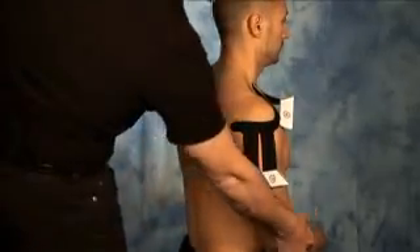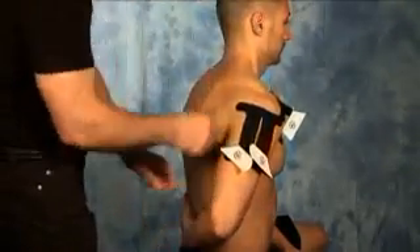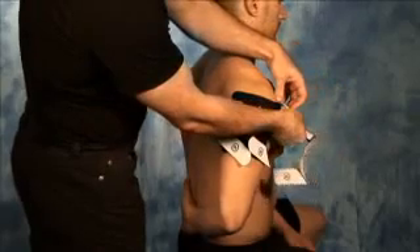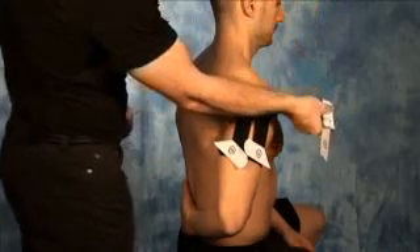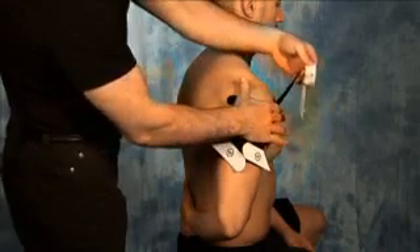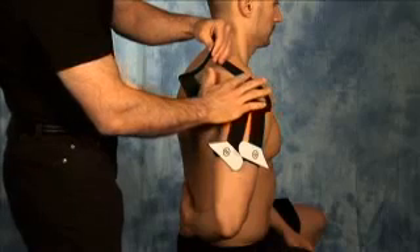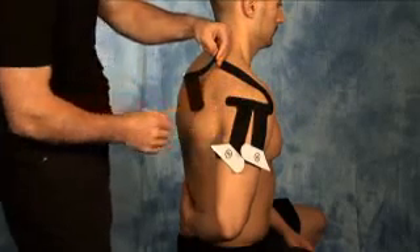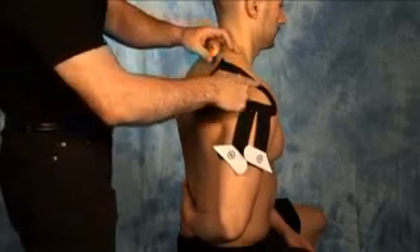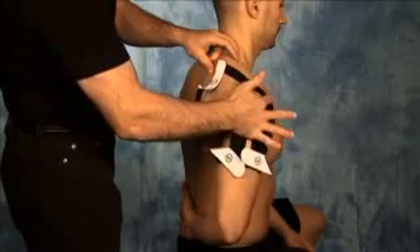For step number two, have the client take their arm and reach it behind their back, stretching out the supraspinatus muscle. Tear the backing off of section two, being careful not to touch the adhesive portion of the tape. Take that section, anchor the base, and stretch the tape gently up and across the top of the shoulder in line with the supraspinatus, coming towards the back portion of the shoulder blade. Once applied, gently rub the tape to ensure no creases have formed and ensure proper activation of the glue.